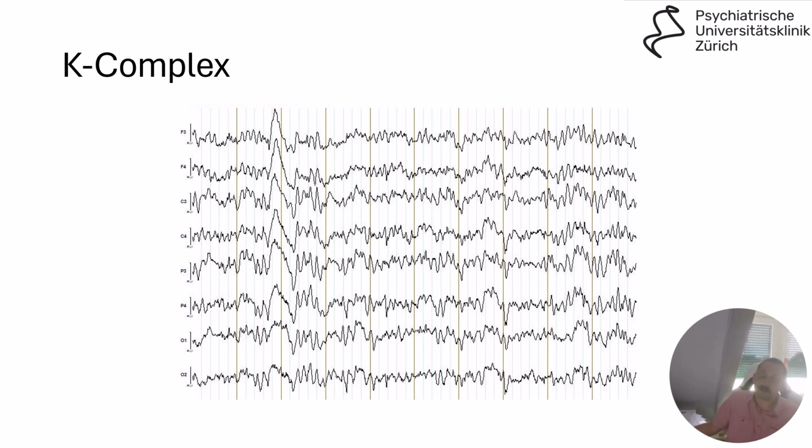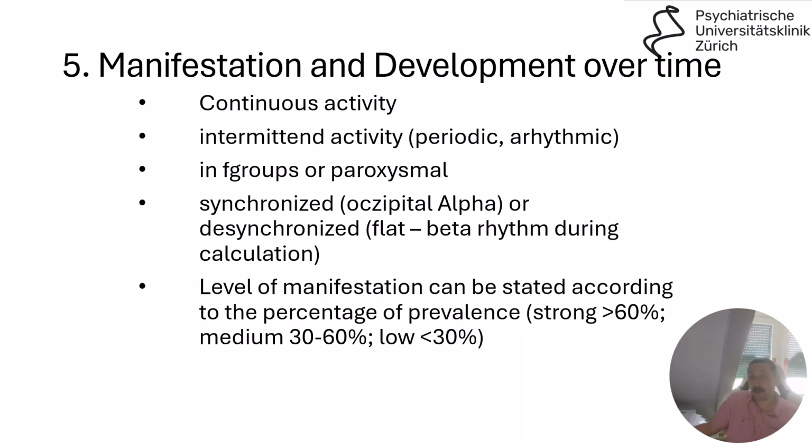And if it occurs, you either wake up from the drowsiness, or if there's no alpha afterward but more drowsiness patterns, this indicates the sleep stage N2. We see the sleep stages later in the next week's curriculum. So this is the K complex.